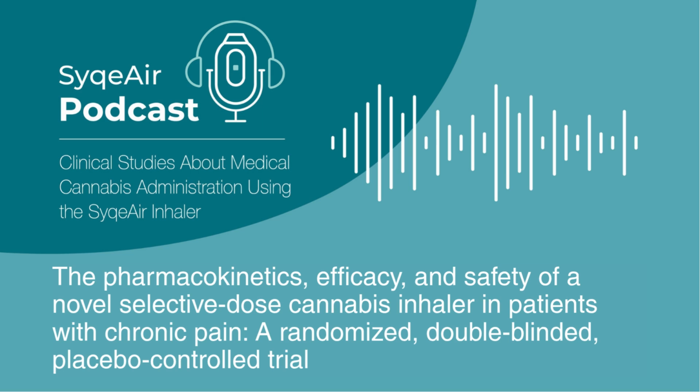This strongly suggests a clear dose-dependent relationship. What the inhaler delivers seems to translate directly and proportionally into bloodstream levels. Which points back to that consistent delivery mechanism working as intended. That kind of predictability is often missing with other methods, especially smoking, where concentrations can be all over the place. Right. The paper explicitly contrasts this with the high variability seen in smoking studies. So it gets into the system fast, and the amount seems predictable based on the metered dose.